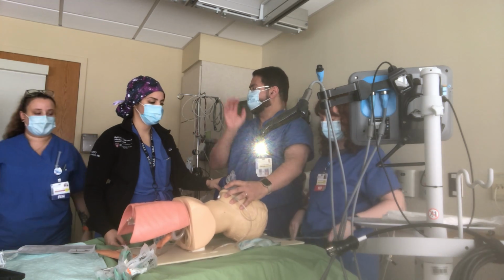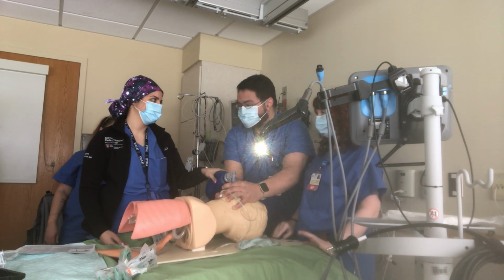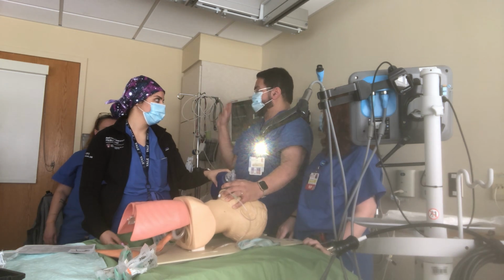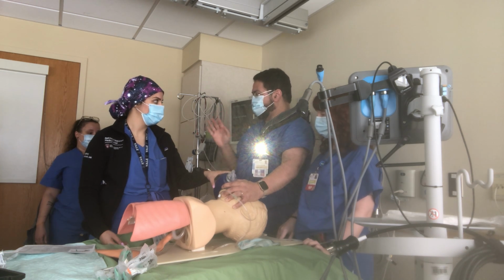How many people can hold this? 8, 9, 100. As long as we can give a seal, we're gonna get very close to each other. As long as we can give a seal and give 2 breaths, we are golden for another 5 minutes, right? 2 breaths with 100% oxygen will give us a good amount of time later.